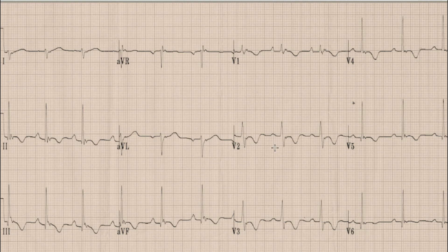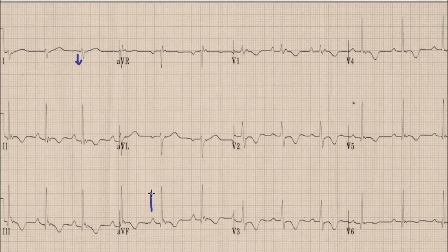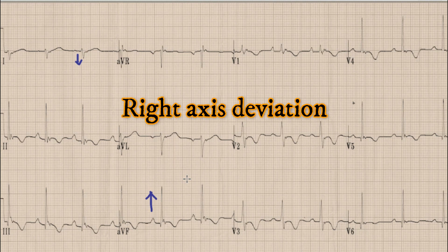The next step is determination of axis. For axis we look at the direction of the QRS complex in lead 1 and lead AVF. In lead 1 the QRS complex is negative, while the QRS complex is positive in lead AVF. By the rule of thumb, a negative QRS in lead 1 and a positive QRS in lead AVF means this is right axis deviation.